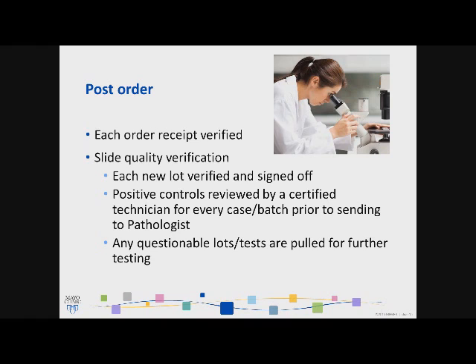So each new lot for an immunostain or a special stain, we have a full sheet that we sign off. Now that we're going into PathDX, as he stated earlier, that I am overseeing the project here for Mayo, Arizona, we're going to be going into TQC where that's computerized, and we'll be able to sign off on it electronically. But right now we're using a paper sign-off sheet, and that's also signed off by our consultant.